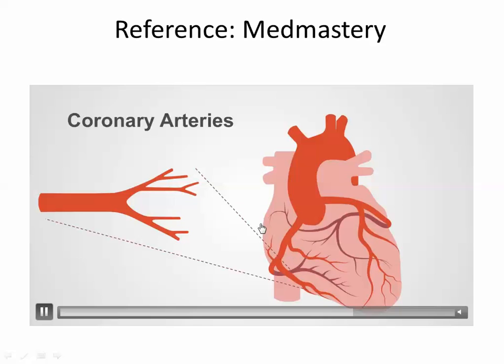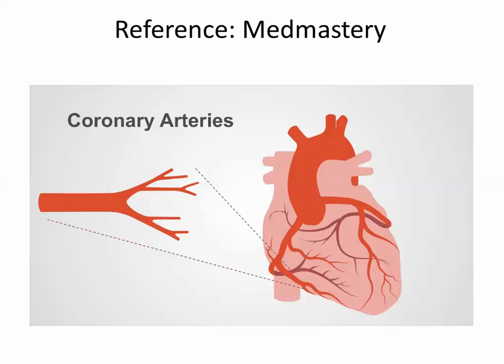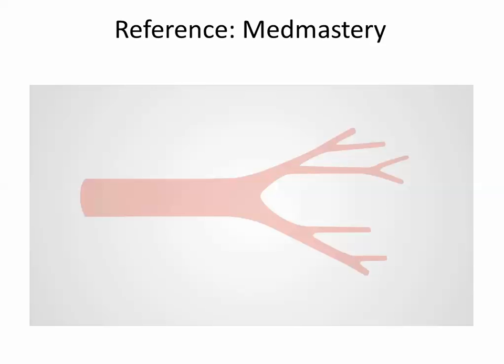Here are the coronaries. Okay, small capillaries, and the capillaries will give you the microvascular circulation. So these are the epicardial vessels, but there are many thousands, or even millions, of capillaries. What we are doing with coronary angiography is just seeing the epicardial vessels, but the microcirculation and the microcapillaries we cannot see.